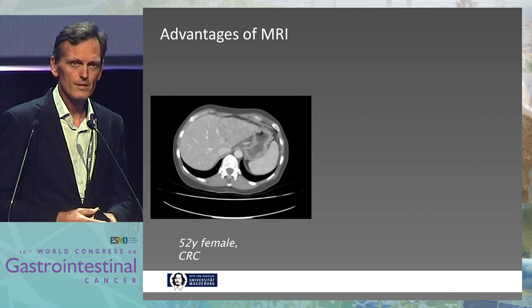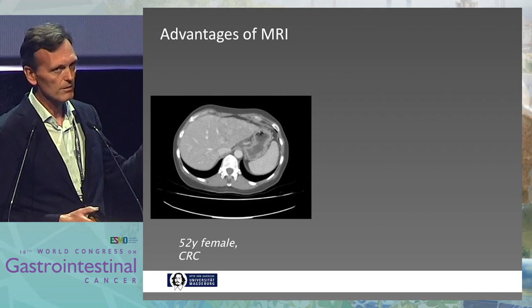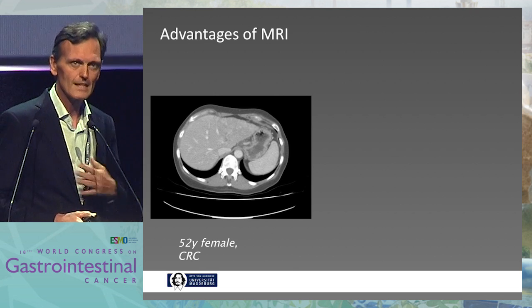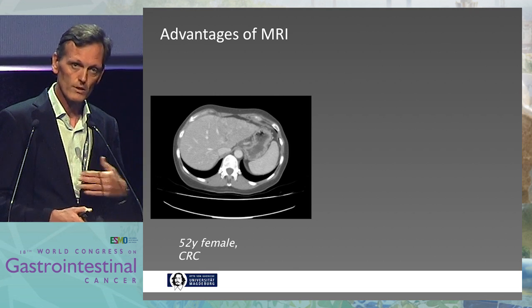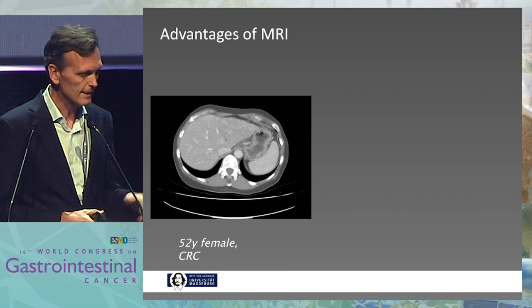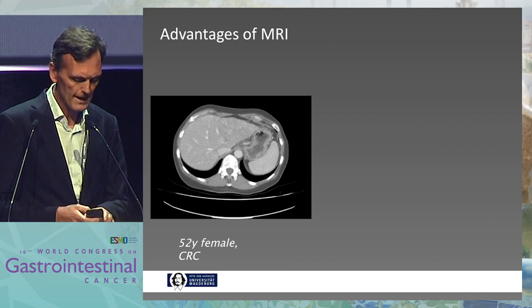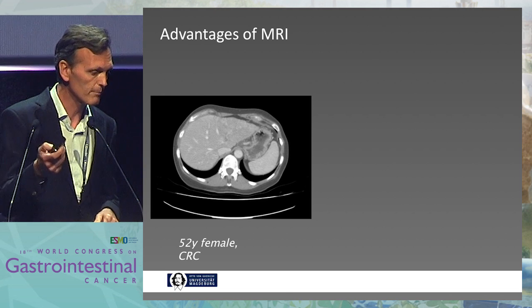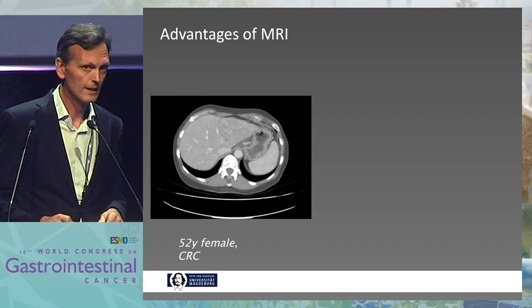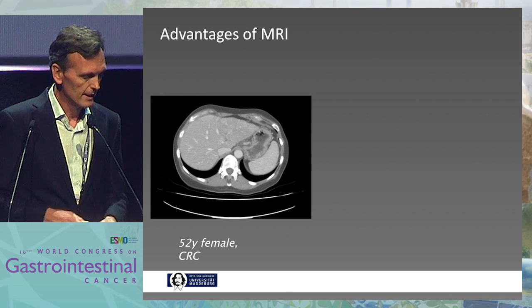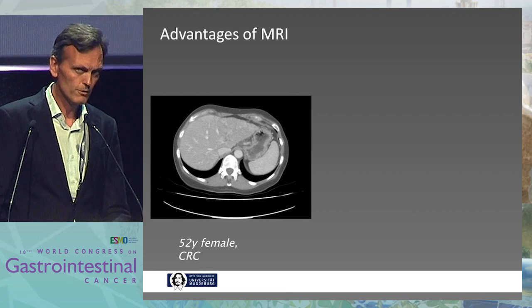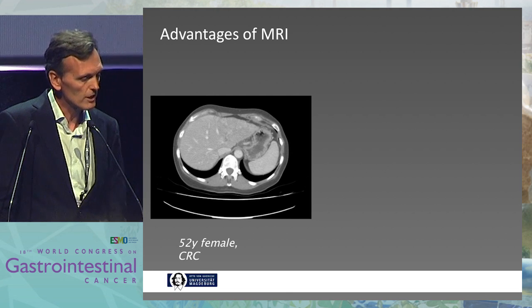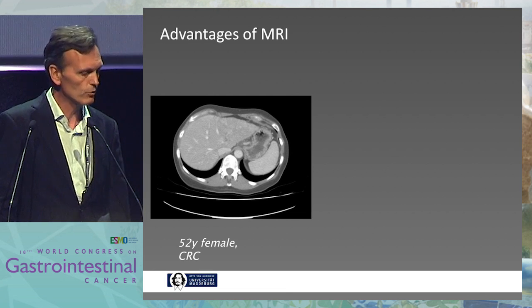Just to give you some idea, this is a CT — and it's a well-done CT technically. The left lobe looks a little unusual maybe, but not really. And if you look at the MRI, you will see that there is a diffuse tumor infiltration, both in the hepatobiliary imaging as well as T2 imaging.